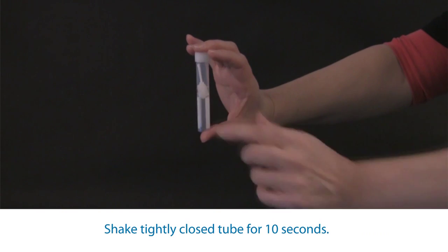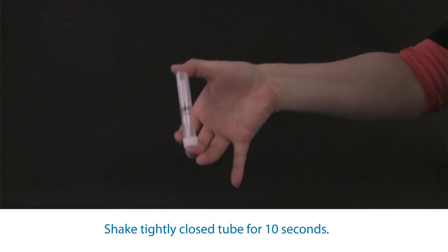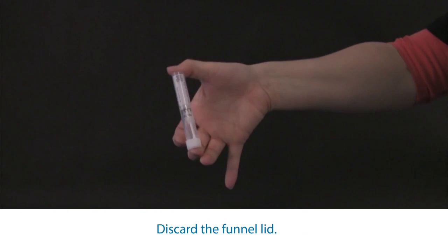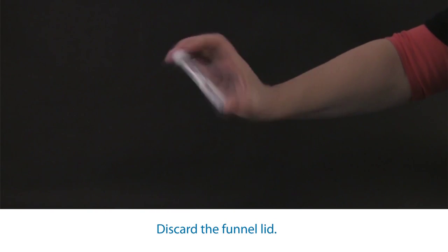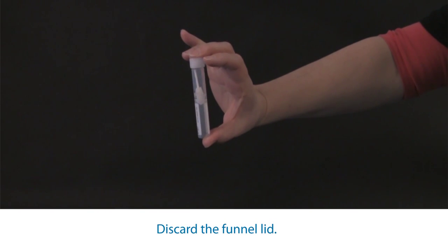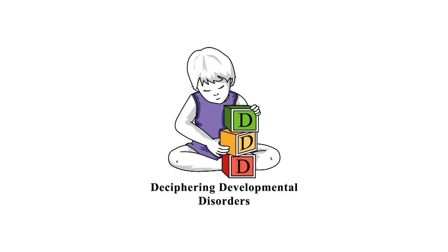Shake the tightly closed tube for 5 to 10 seconds until the saliva and liquid are mixed. Place the closed tube into a specimen bag with absorbent paper and seal the bag. Place the bagged sample or samples into the pre-addressed free post padded envelope and put it in the post.